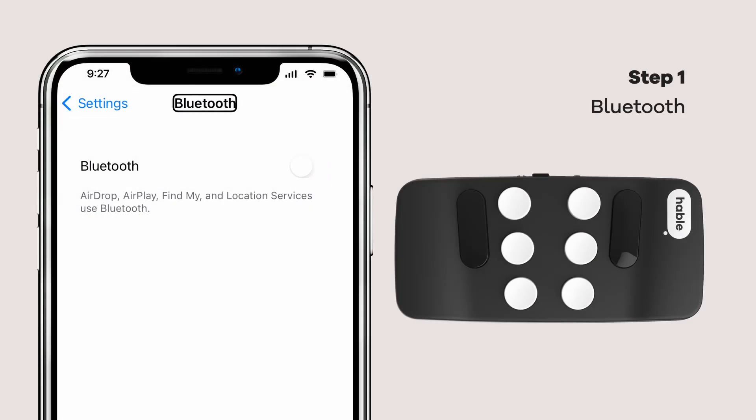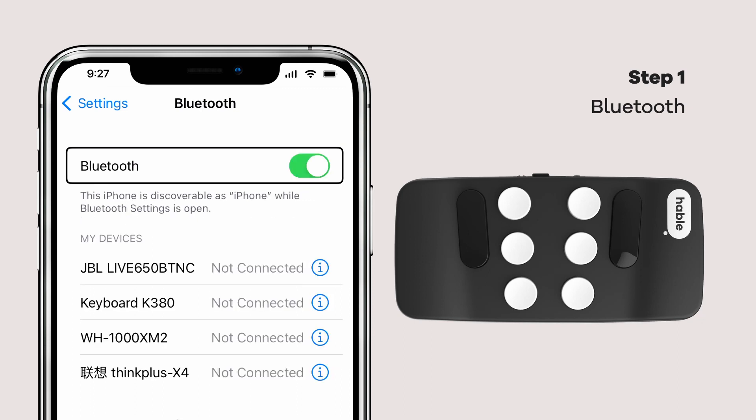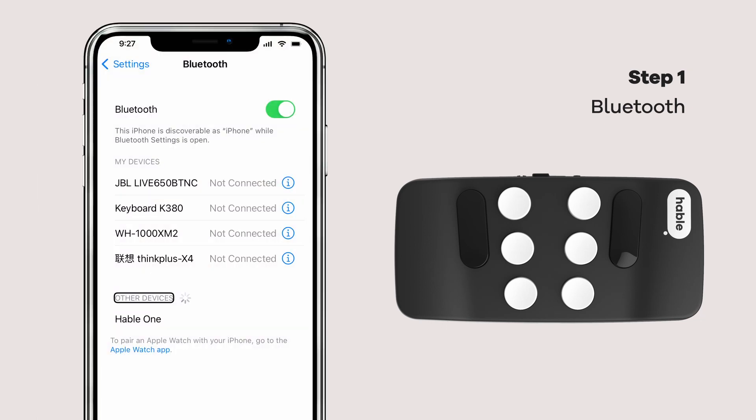Now, let's set up the Bluetooth connection. Go to your phone's Bluetooth settings and turn Bluetooth on. When you spot the Hable 1 among the list of devices, tap it to start the connection.